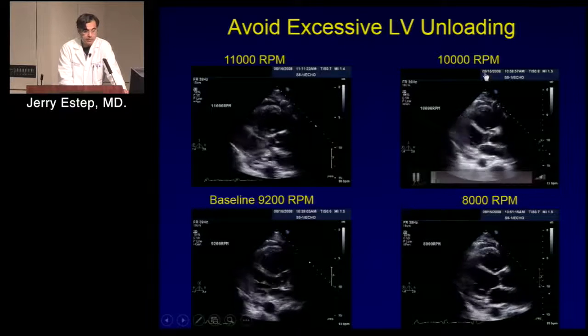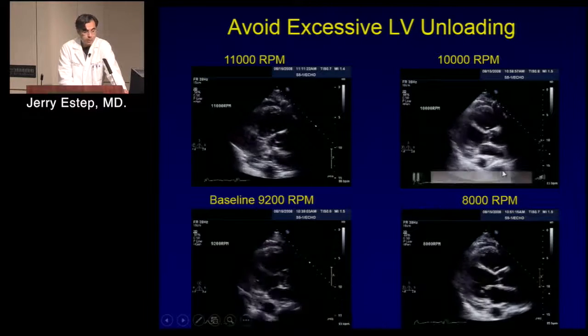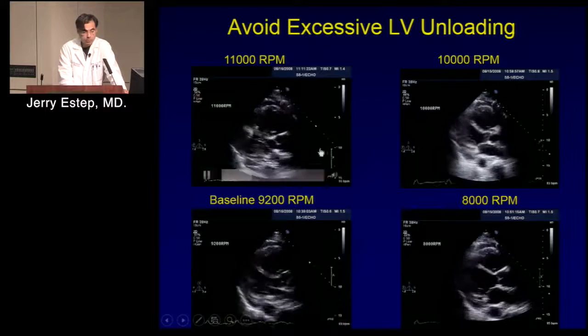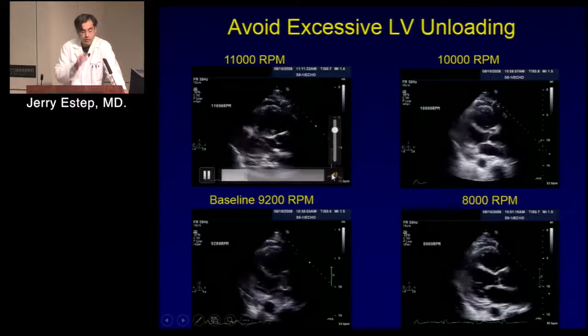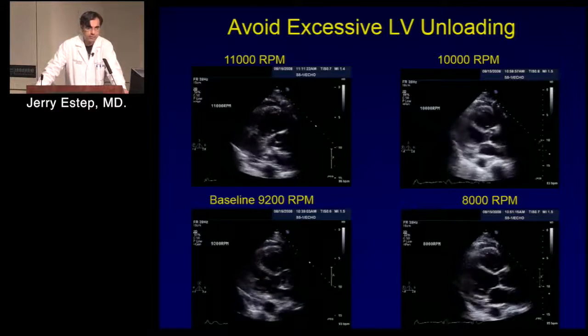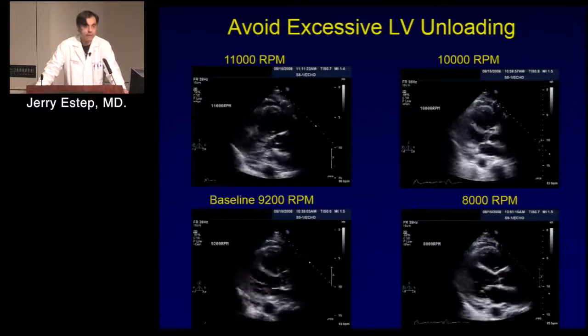In this particular patient, even at 10,000 or even at 9,200, you see how the LV is very, very small. This patient's at risk for true suction events. And so to answer your question, Dr. Q, at 4 weeks, we're making it in real time, and that's the pump speed we hope is the definitive pump speed guiding that patient.